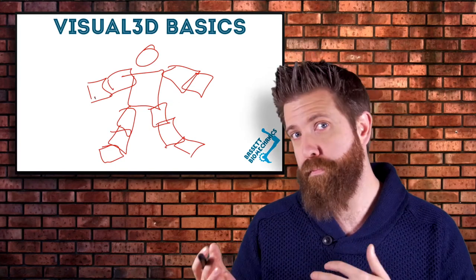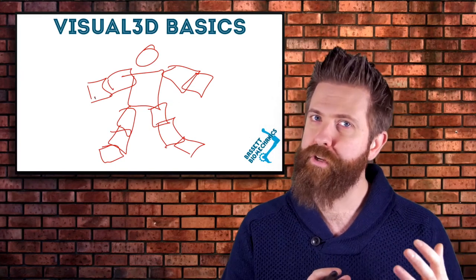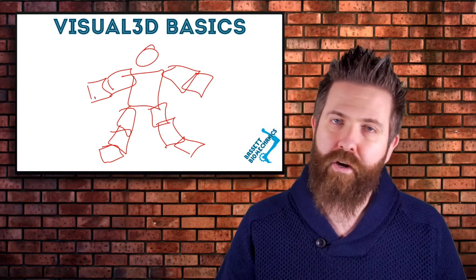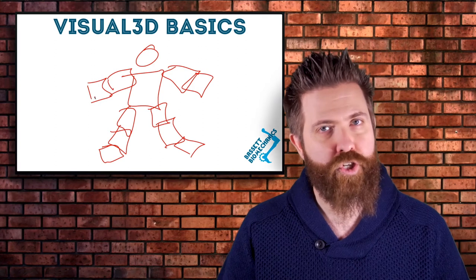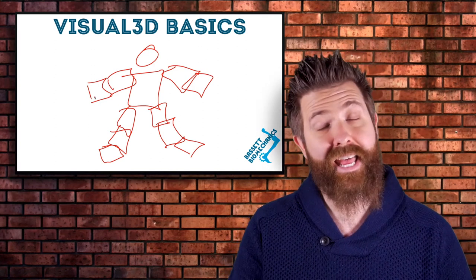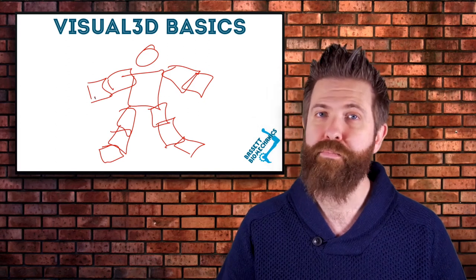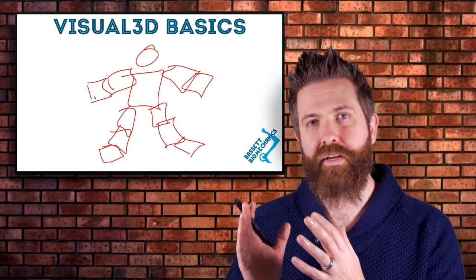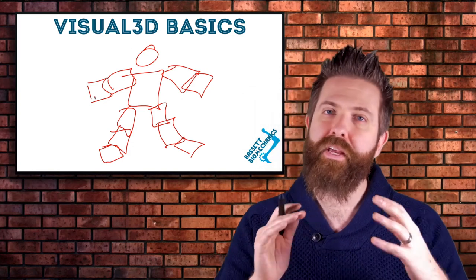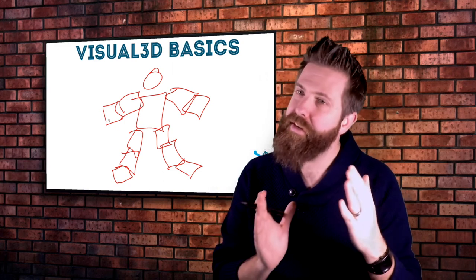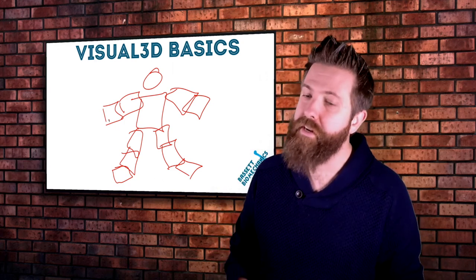Beyond being able to apply Visual 3D to multiple platforms, once you've created your biomechanical model, it can actually be shared across projects and between labs as long as your marker data, or if you're consistently using an XSense system, as long as your original data is labeled the same.